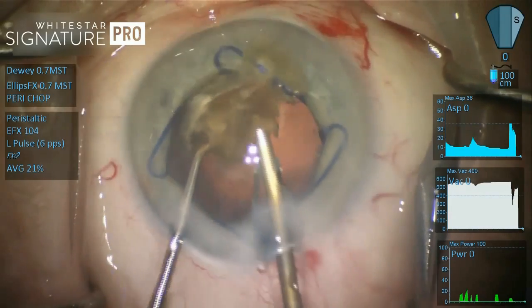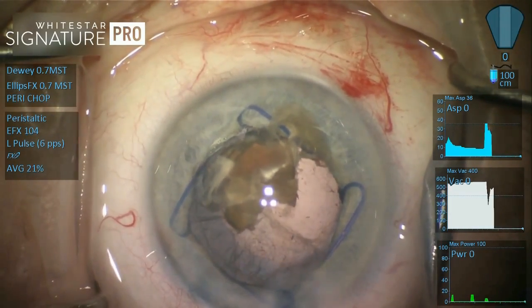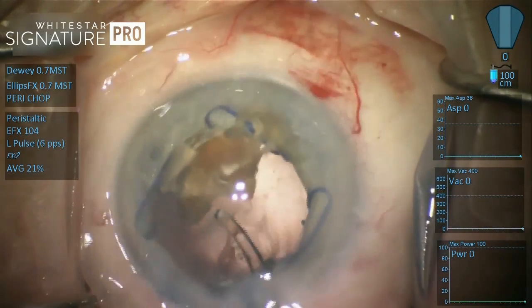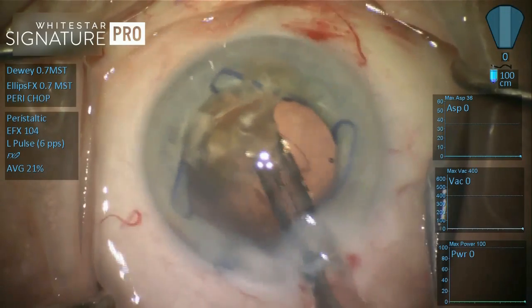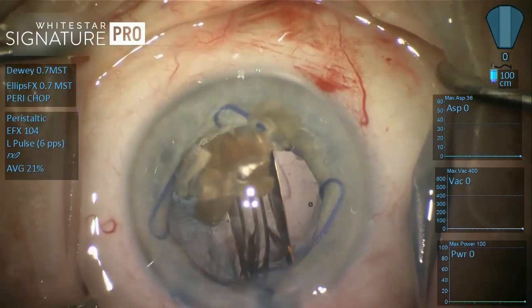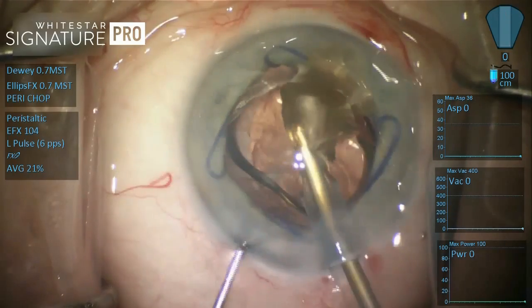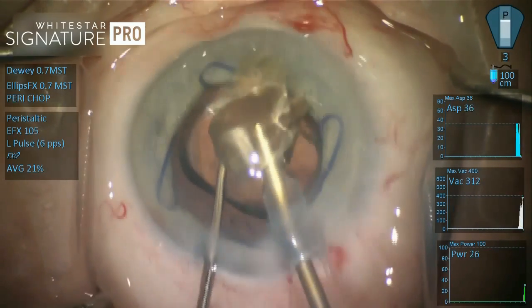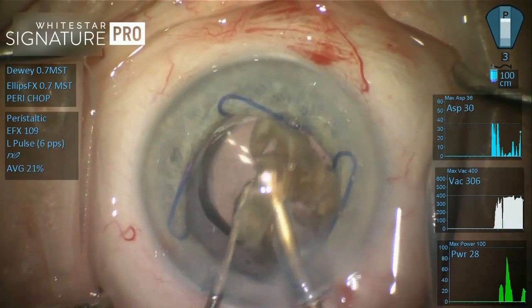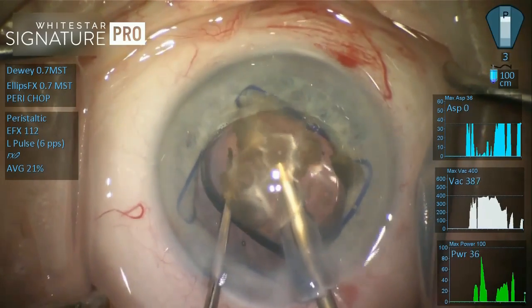And so I do prefer to use the rounded needle because the sharp edge can initiate a cut in the posterior capsule. It can shred the posterior capsule if you're applying power at the same time. So I could enlarge the incision and express the nucleus, but at this point in time I really wanted to go ahead and put the posterior chamber lens implant in, preserve the small incision, even though we're not as worried about astigmatism as we are about just a watertight incision. And so you look, and there isn't even a lot of stromal hydration of the incision, which I am exceptionally pleased by in retrospect.